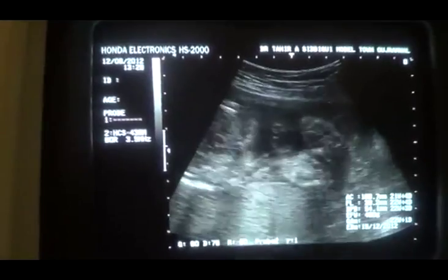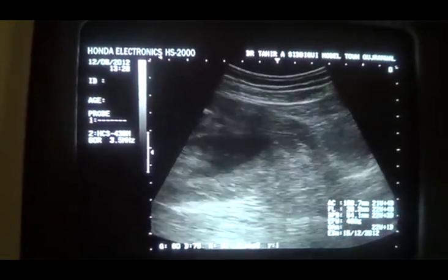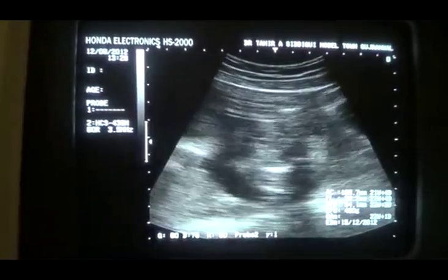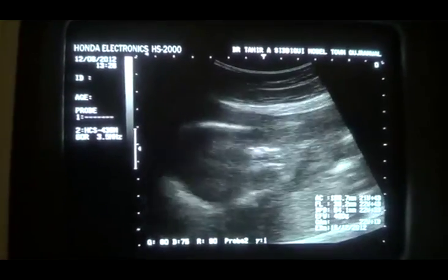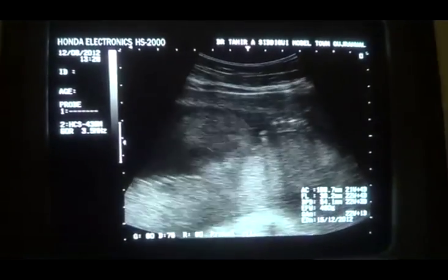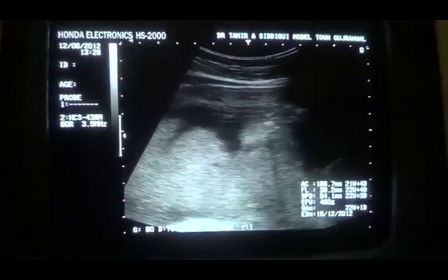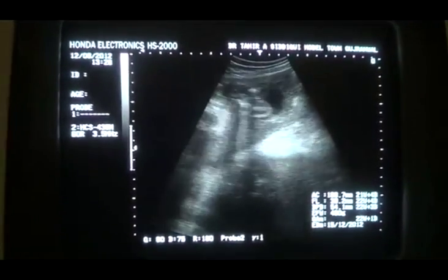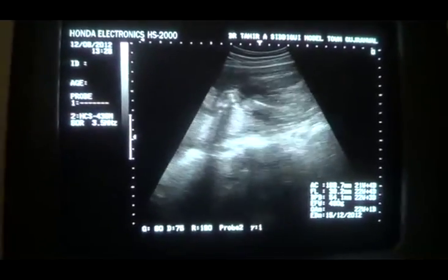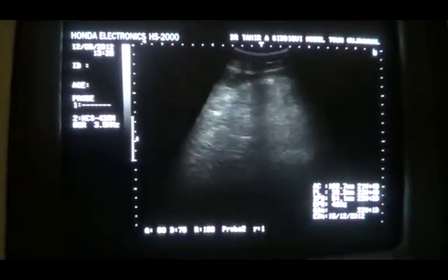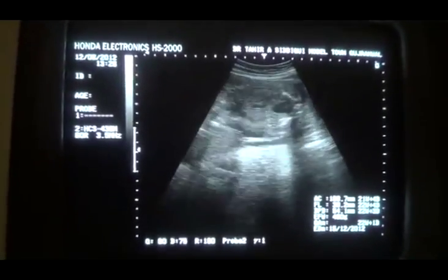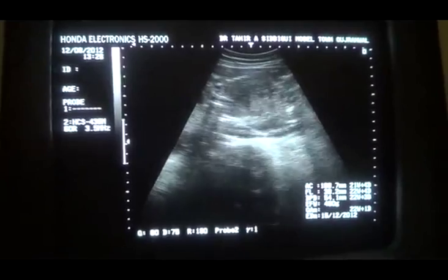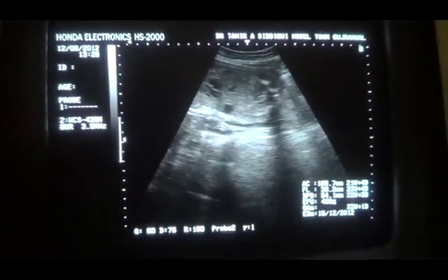The amniotic fluid is adequate. The internal os is closed — this is the internal os. This is the placenta. The placenta is grade 2 and it is on the posterior wall, right above the os.